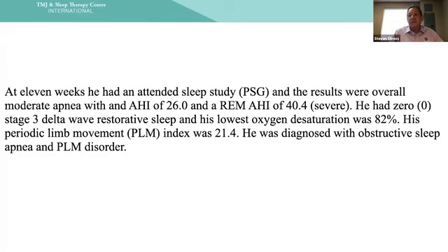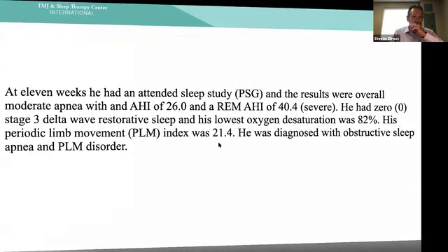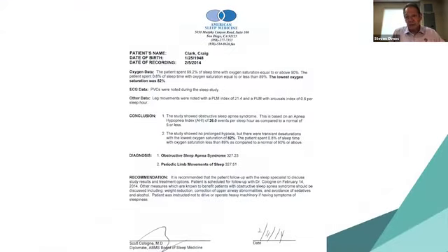During REM, which is the part of sleep, rapid eye movement, where your body is pretty much catatonic, all the muscles are relaxed. Your ocular muscles and your diaphragm are functioning, but everything else is limp, including your airway. So that's why we see an increase, and you can see his number went up to 40 during this time. And he desatted to 82%, so that's not good. Your oxygenation at sea level should be 99%, and he also had periodic limb movements. So he had a number of sleep disorders, and he was diagnosed as such.